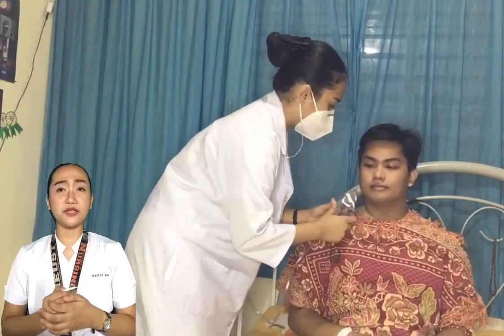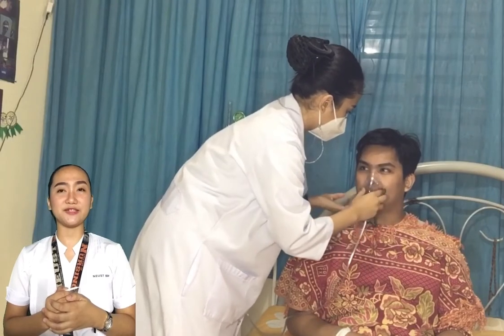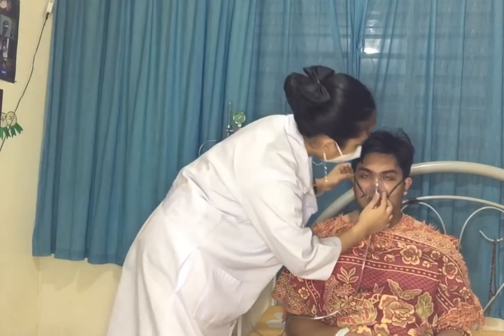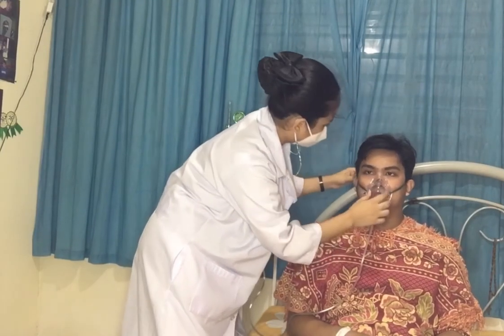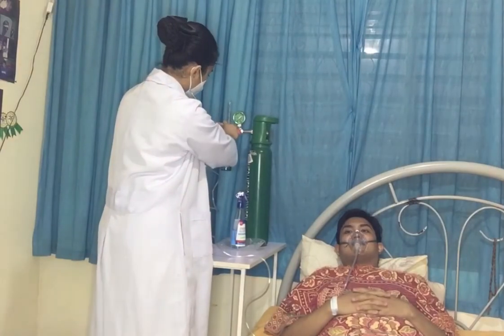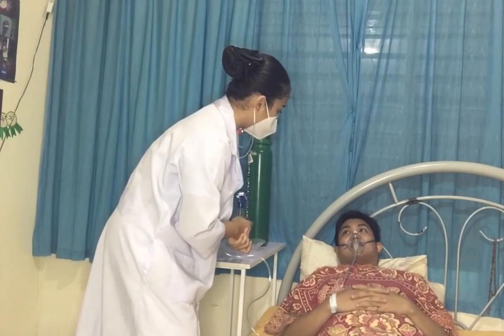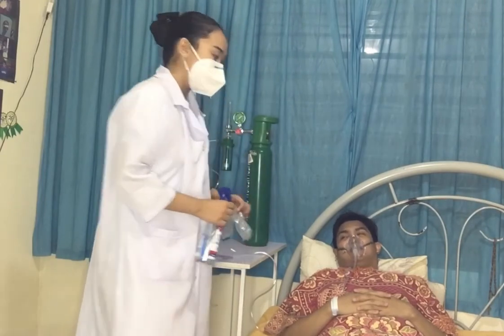If the patient reports irritation or redness is noted, use gauze pads under the elastic strap and at pressure points to reduce irritation to the ears and other pressure areas.